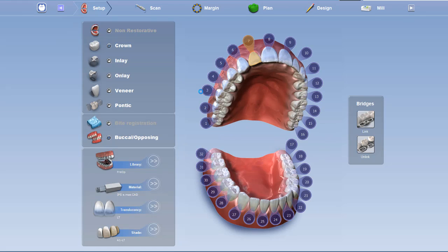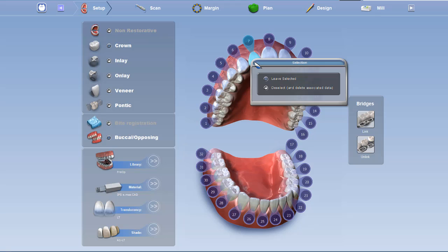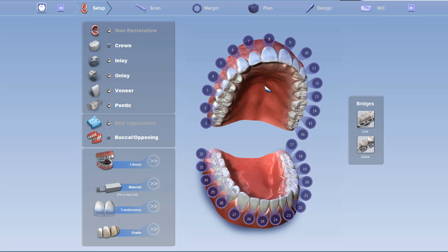So you'll notice here, tooth number seven is selected. Then I can right-click, deselect tooth number seven, and then reselect the correct tooth that I want to select.